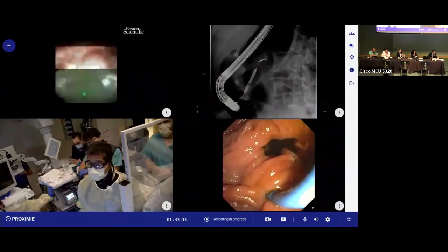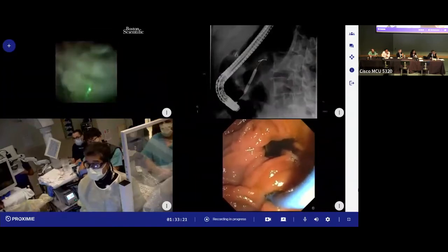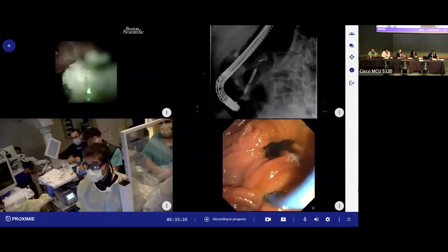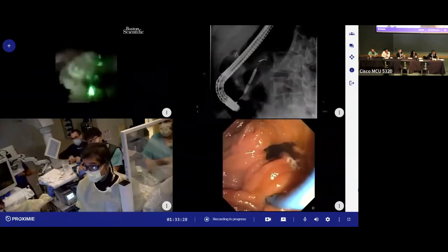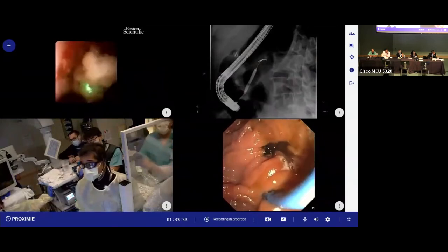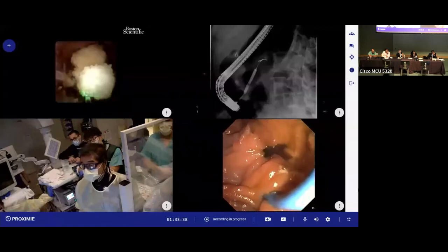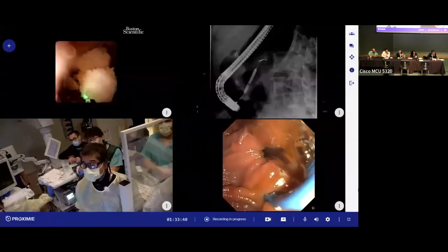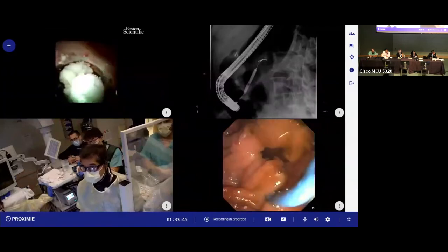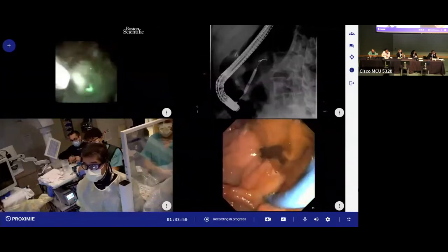And then, can you hear me over the lithotripsy? Yes. Okay. And then, yeah, so now we're well beyond the stricture. So we start upstream to downstream. And then the number of strokes, it depends. It's sort of like needle knife, like you start with superficial layer, you don't feel like you get much effect. And just like with needle knife, right? You can't take away, but you can keep cutting. So I kind of approach it that way. I don't know if that answered your question, Sachin. That was good.